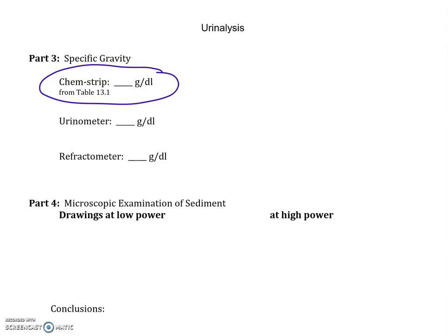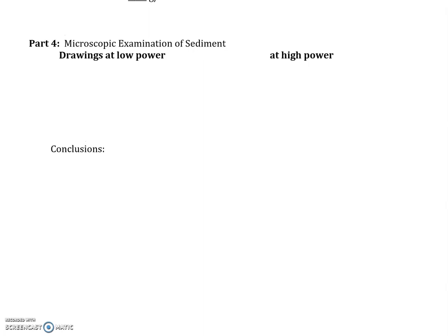Okay, so now the urine sediment, I'm going to refer you to that tutorial that you are supposed to watch for this week. It's a really good tutorial about somebody doing a urinalysis lab, and you're just watching them do it and explain about the different fields that are on a urinalysis stick. It's a really good tutorial, so you should definitely watch it. It also explains about urine sediments and what that would look like.